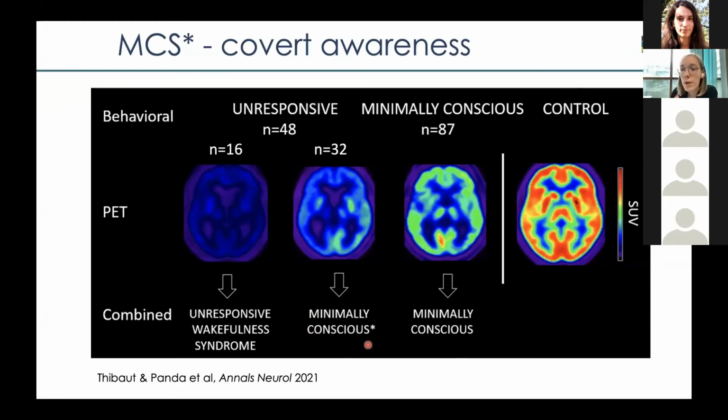So even if there is no behavioral evidence for the presence of conscious awareness, there is some cerebral activity that is most likely able or shows a capacity for consciousness. And it is for these patients, of course, very important to get the right diagnosis, because outcome and also treatment choices will depend on such a diagnosis.